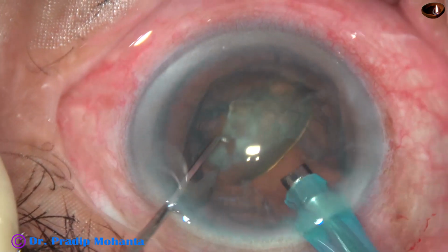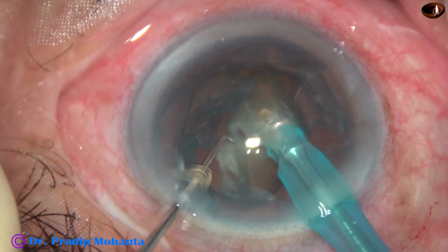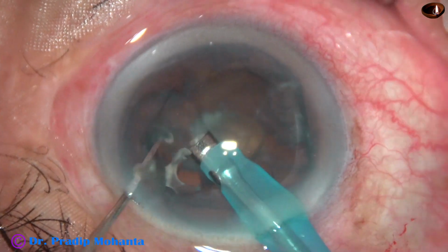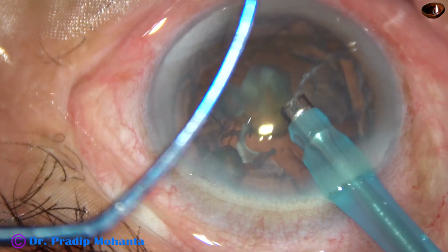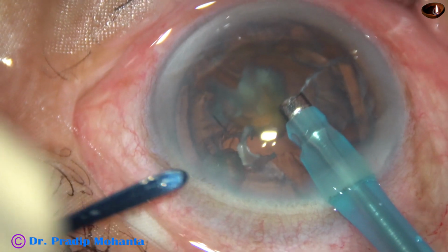And now see the last piece. Divide it, place one piece below and emulsify the piece which is above. And now before emulsifying this last bit of nucleus, introduce the posterior capsular protector.